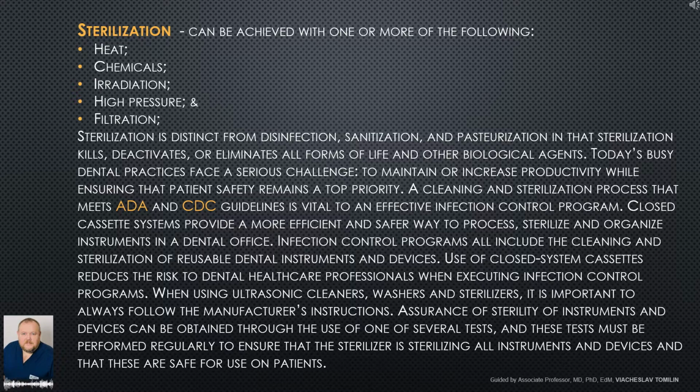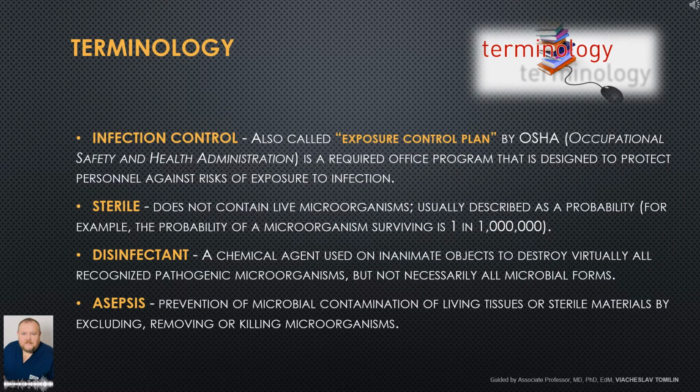When using ultrasonic cleaners, washers and sterilizers, it is important to always follow the manufacturer's instructions. It is also important to consult with the manufacturer of dental instruments and devices as needed to ensure complete sterilization and to avoid damage to these items. Assurance of sterility of instruments and devices can be obtained through the use of one of several tests, and these tests must be performed regularly to ensure that the sterilizer is sterilizing all instruments and devices and that these are safe for use on patients.